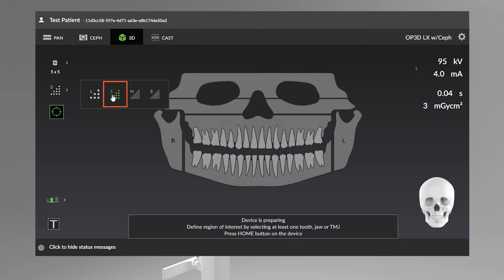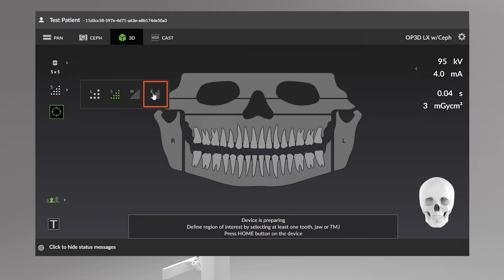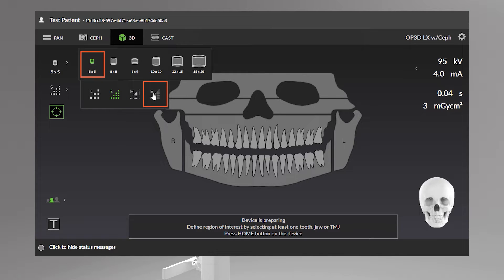Resolution options include low, standard, or high. There is also an endo resolution available, only for the 5 by 5 field of view. The list of available FOV sizes depends on the device configuration and country specification.